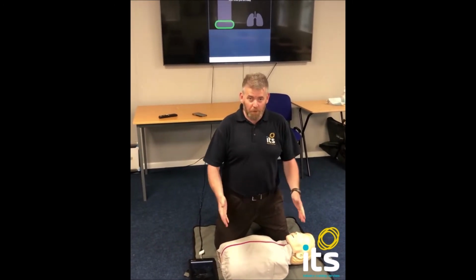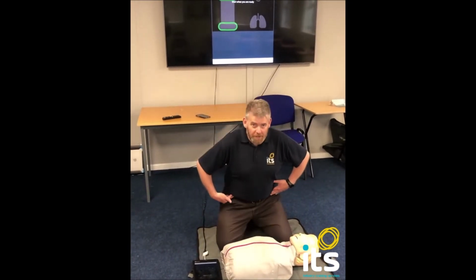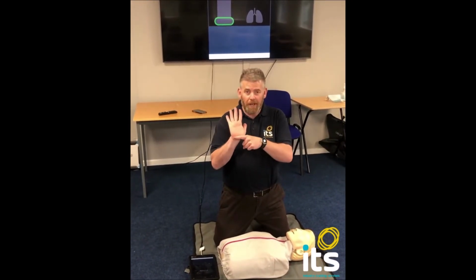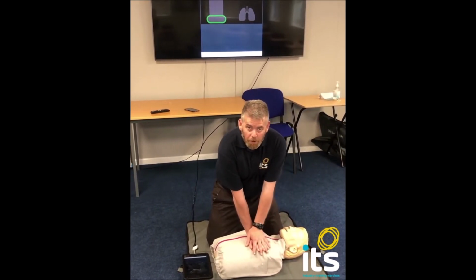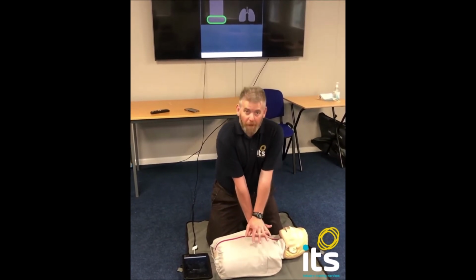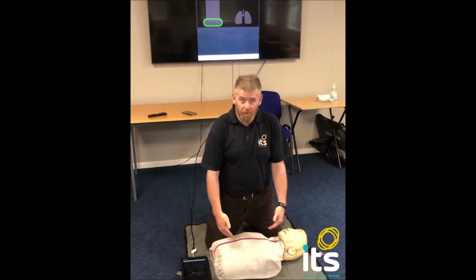Important to note, your knees need to be in touch with the dolls. You need to be sitting up on your hips, not backwards like that. Up nice and forward with a nice straight posture. The heel of one hand will go onto the centre of the chest, onto the sternum. The other hand goes on top. And all I'm going to do now is keep my hands in that position, lock my elbows out, and rock backwards and forwards on my hips, just like a crocodile's jaw opening and closing, to ensure I get the distribution of even weight across them.